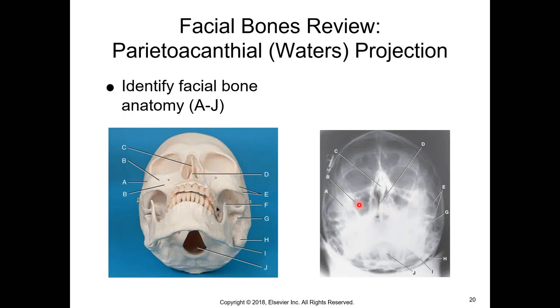C right there. E is going to be your zygomatic arch. So this section here, see how it goes around? Here you go. That's a little bit easier to see on this guy than it is on your radiograph, but that's your zygomatic arch. There is no F on your radiograph. The F on your little skeleton guy here is the coronoid process, but you can't really see it here. I mean, if you wanted to see it, it would be located right in this region here for F.